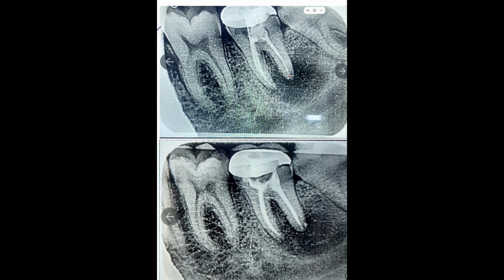So it's always very important to seal the apex properly to achieve the maximum apical seal and to reduce the risk of reinfection. Now you look at the difference between both these obturations. When you see, I'm again focusing specially on this distal canal.